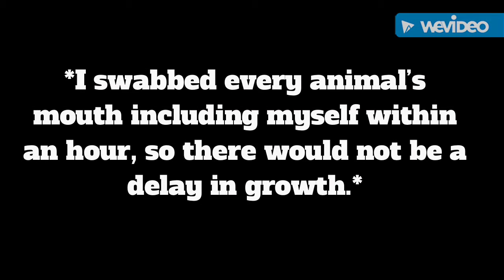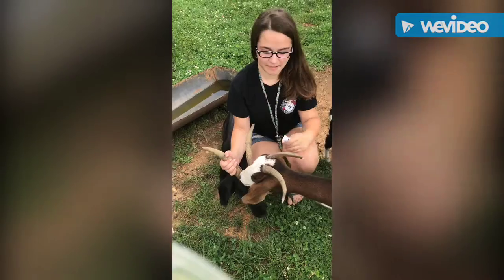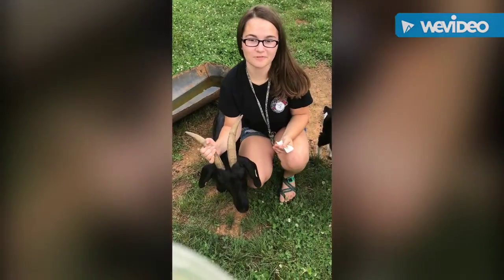For this part of the experiment, I'm going to be swabbing a variety of different animals' mouths. So, I have a goat, a cow, a dog, cat, horse, rabbit, and myself. So I'm going to have human and different kinds of animals. Okay, this is me swabbing my 4-H project goat, Darling.